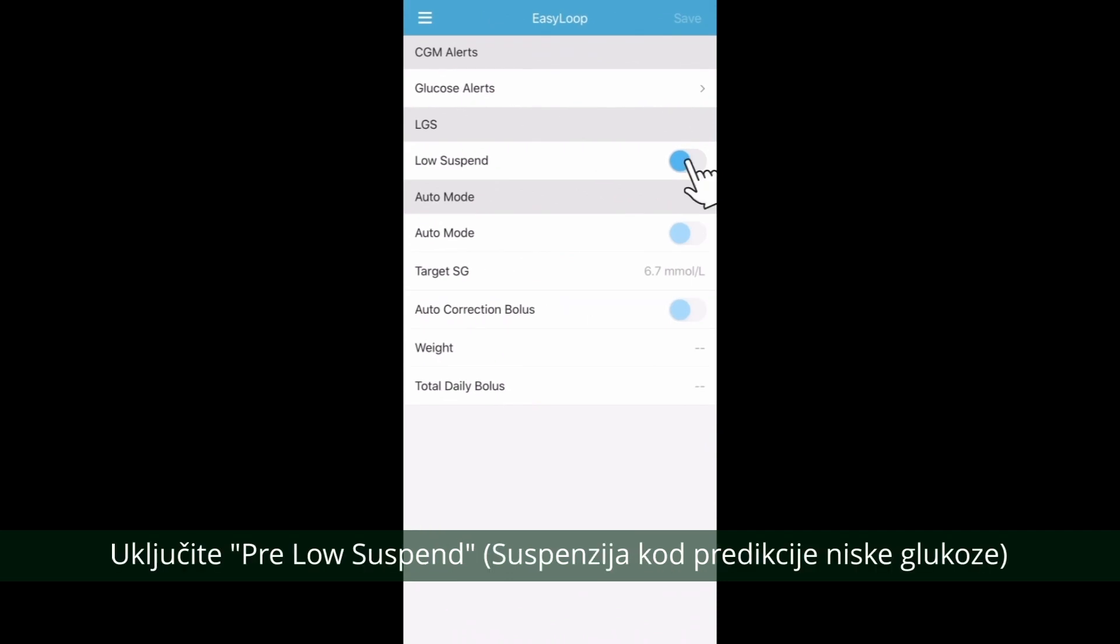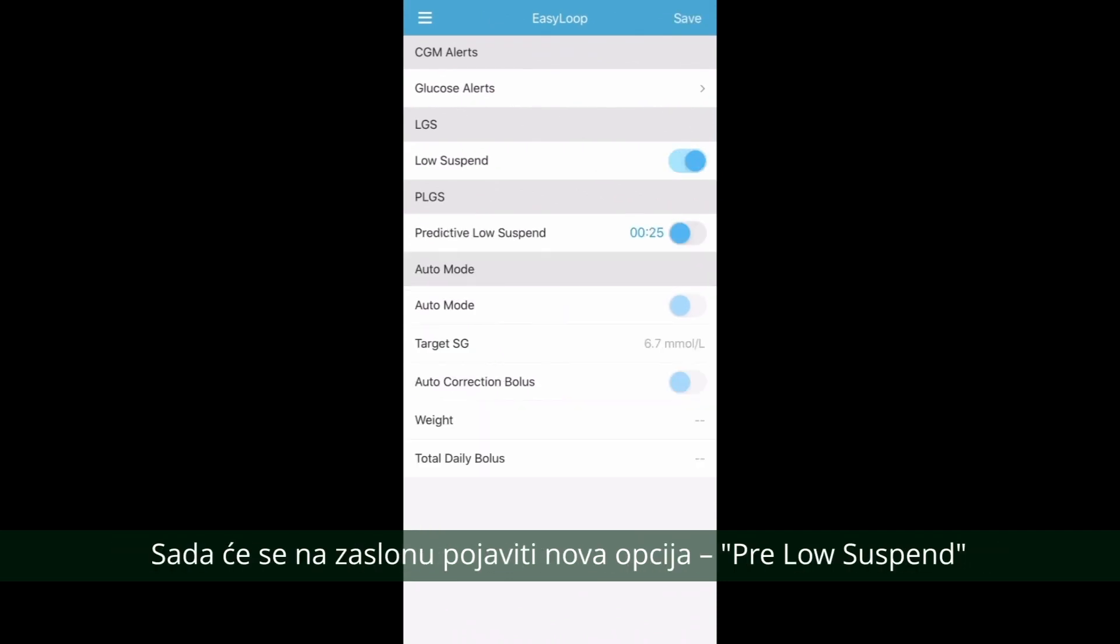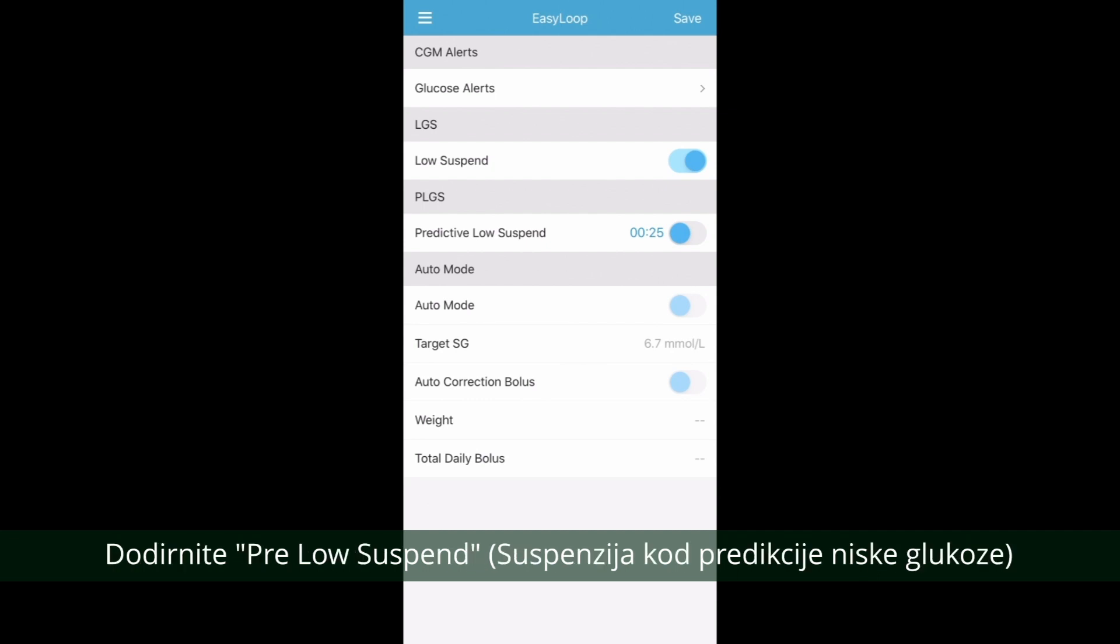Turn on Low Suspend. A new option will now appear on your screen, Predictive Low Suspend. Turn on your Predictive Low Suspend.